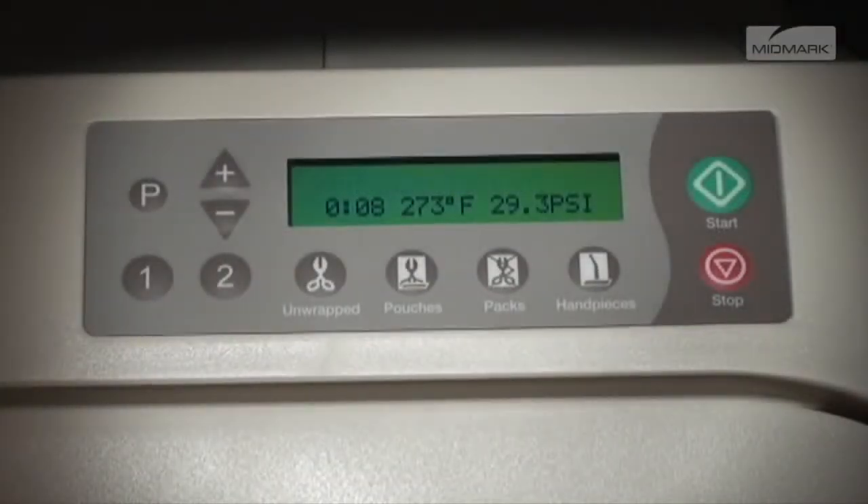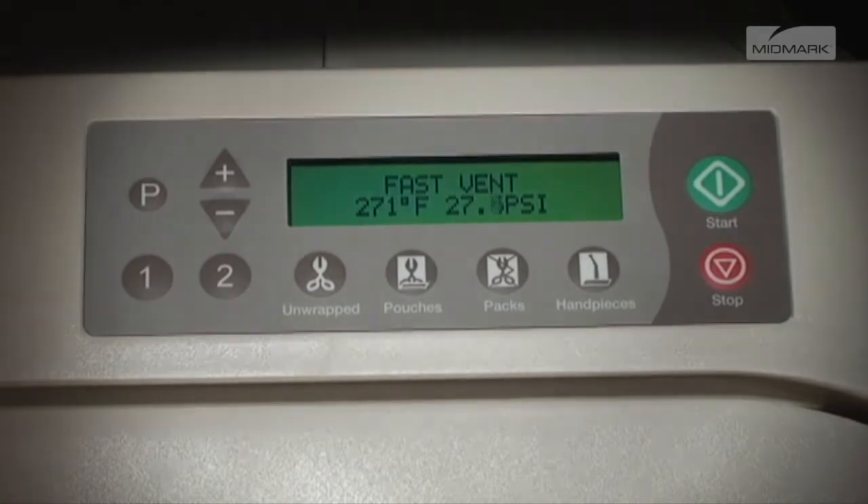Just prior to the end of the sterilization cycle, 'Ready to Vent' is displayed for 10 seconds and the vent cycle begins. The vent valve opens and steam and water is released back into the reservoir. The display changes as temperature and pressure in the chamber changes.